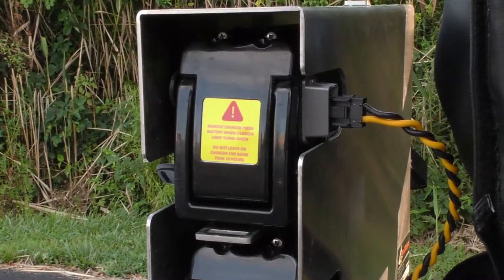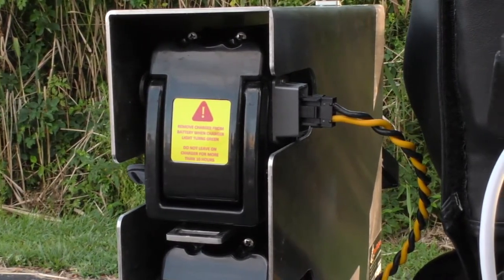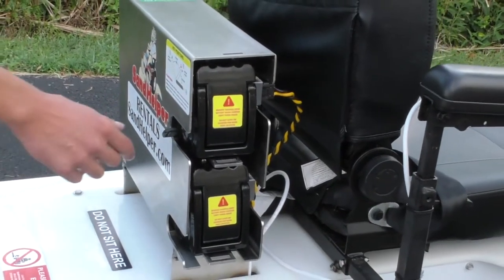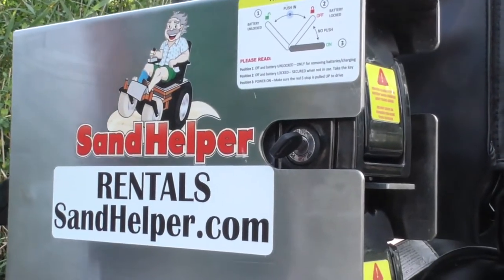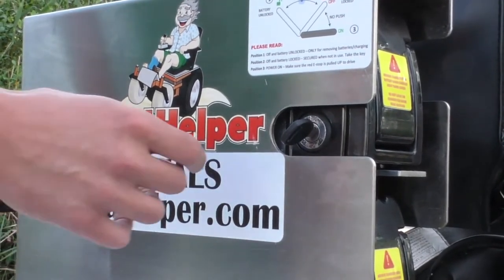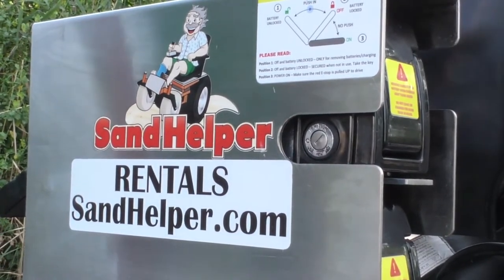The wheelchair operates on one battery at a time and you have another one as a backup. Whichever battery you are currently using, you need to have the power cable — which is on the front side of the battery — plugged into that battery, as well as the key on the back side of the wheelchair. Currently we are plugged into the top battery, the key is in this battery, and we are in the off and locked position. This is the position the key should be in when you are not using the wheelchair and you have the key with you.